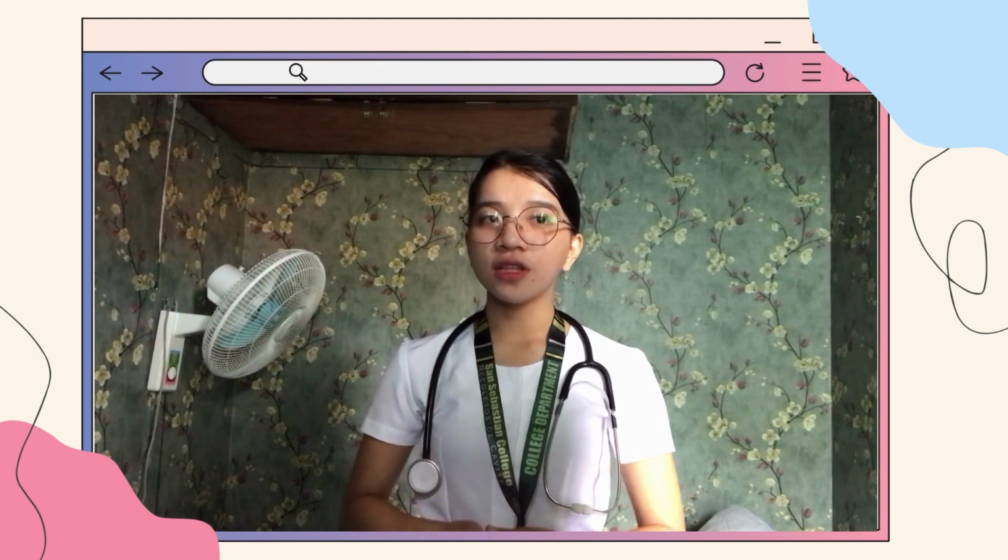The next is respiration rate. In respiration rate, we must observe the client's chest movement. And lastly, the blood pressure. In line with that, we know if the patient is experiencing hypertension or hypotension, which affects blood pressure. Now you know the importance of vital signs, and today I'm going to show you the paraphernalia needed.